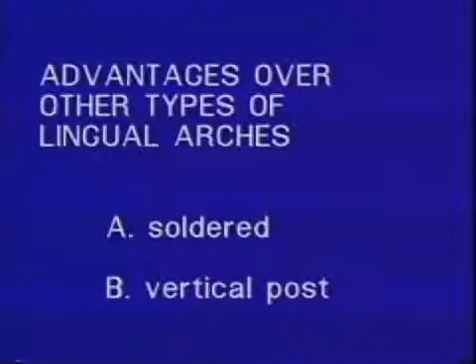The vertical post is fully adjustable, but it occupies a greater amount of space on the lingual surface of the teeth and requires a locking position which is well within the soft tissue. I would like to review a series of slides showing the disadvantages of these two other lingual arches.